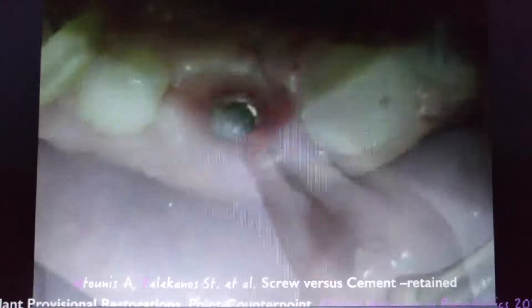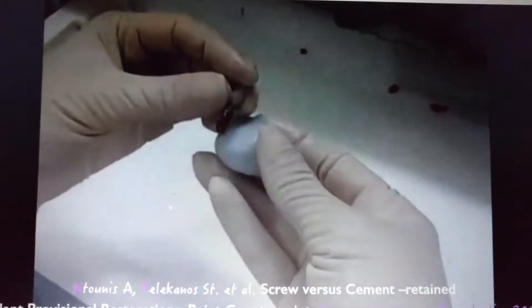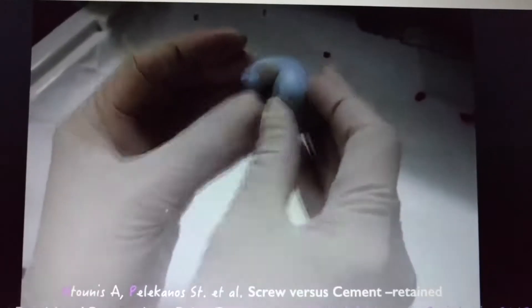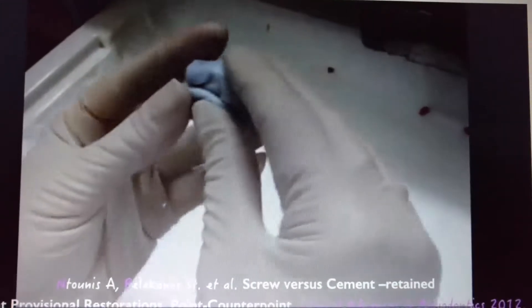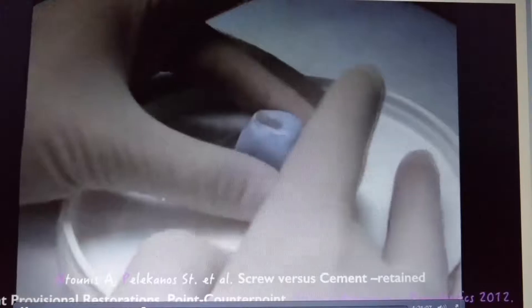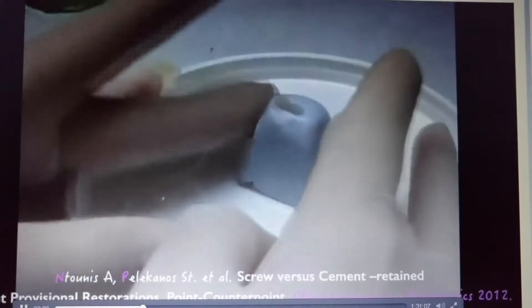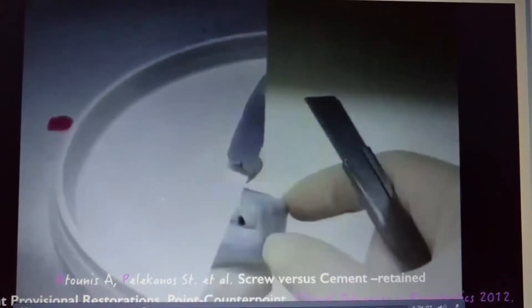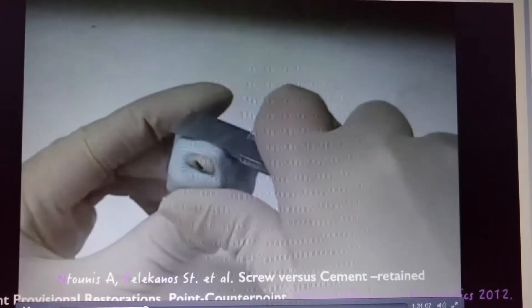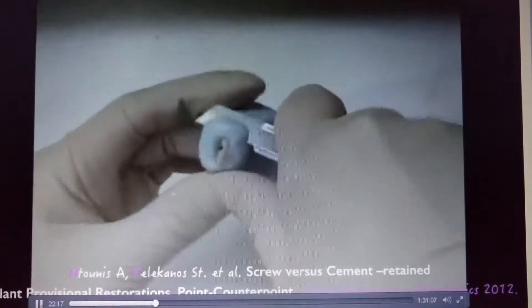Our emergence profile is being copied for the final restoration. On this video here, all we need is a little bit of silicone putty that goes around the maximum circumference of that tooth. An implant replica is connected to the provisional restoration before we do that.